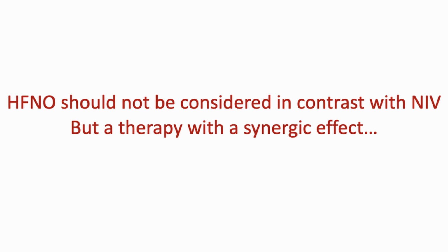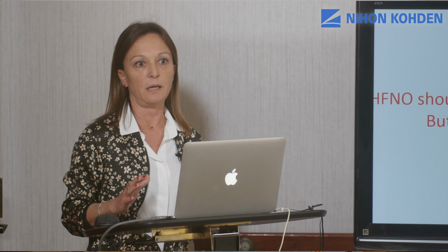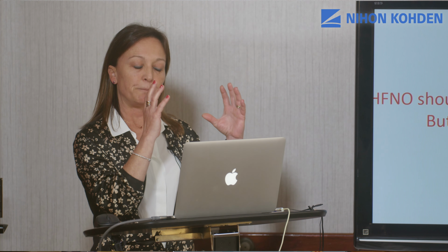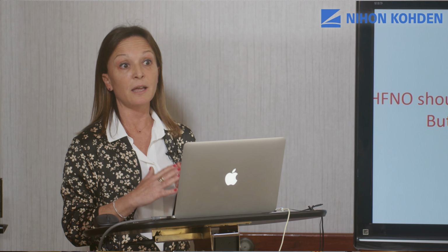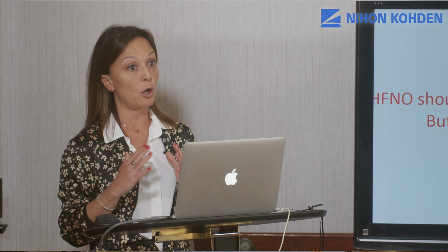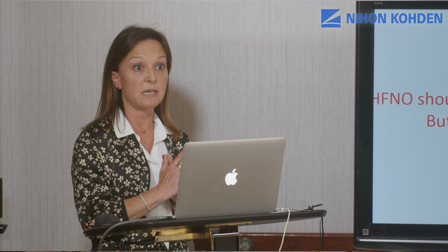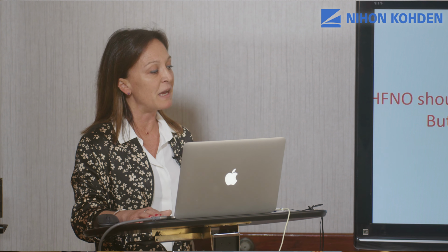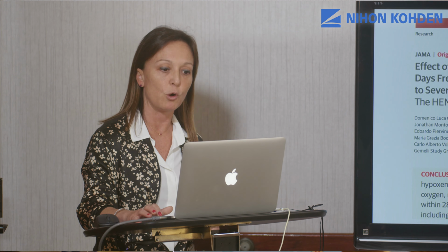However, I grew up with NIV. I use NIV with face mask, with the helmet. So I was really skeptical at the beginning with high flow nasal cannula. But I think also because people were trying to take high flow nasal cannula as an alternative to NIV. High flow nasal cannula cannot be considered an alternative to NIV. They are two different strategies that can be considered synergic in our patients, and that can help us in treating our patients at best. So this is, I think, the best way to use both, without saying, no, I cannot use NIV because I have high flow nasal cannula.